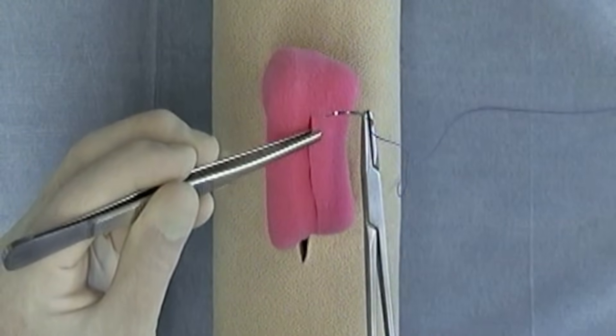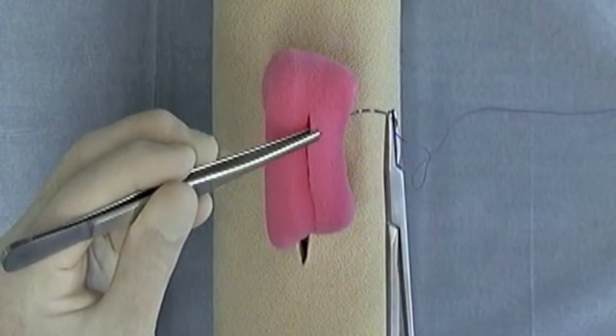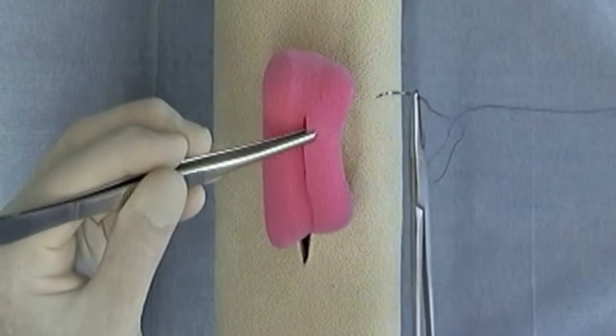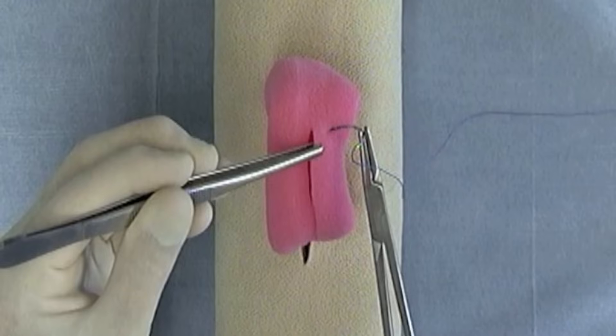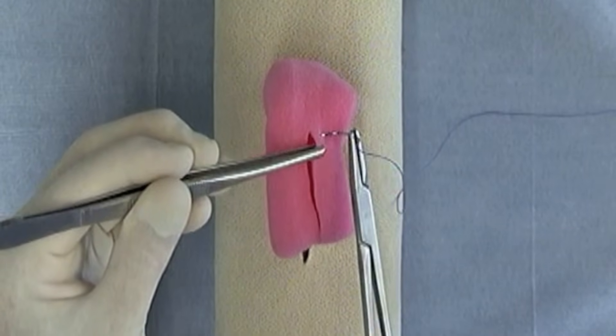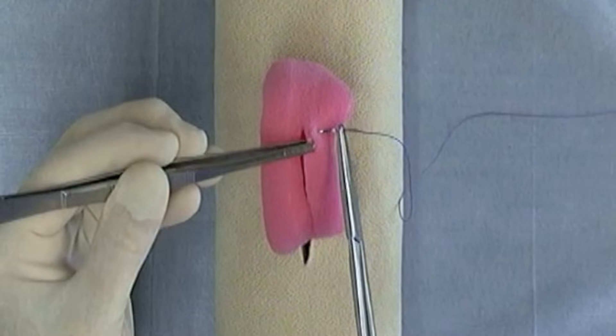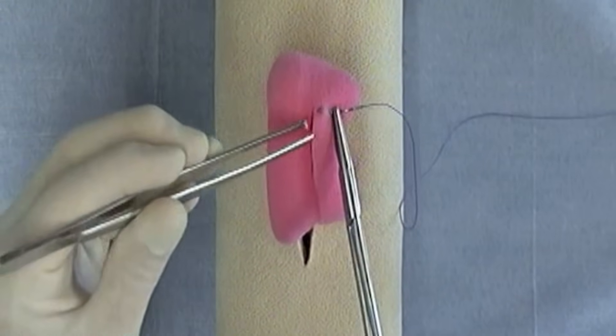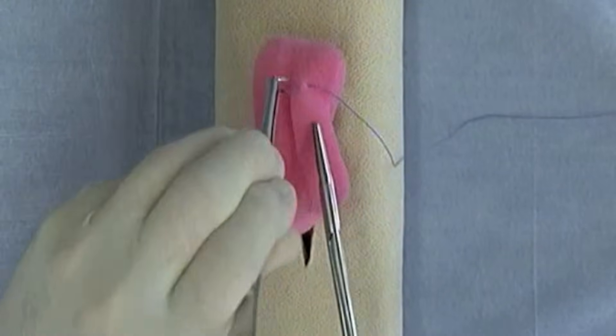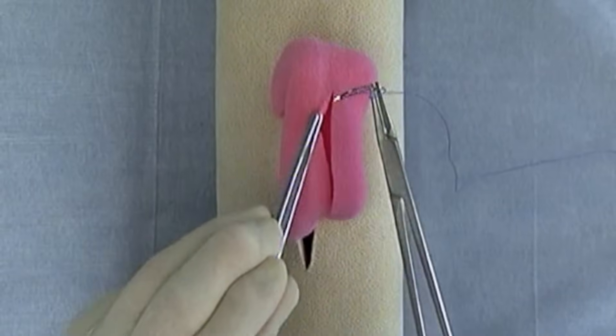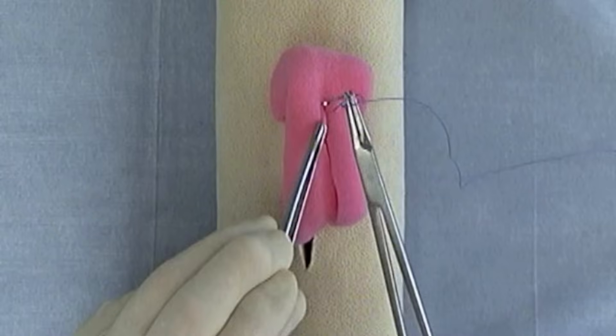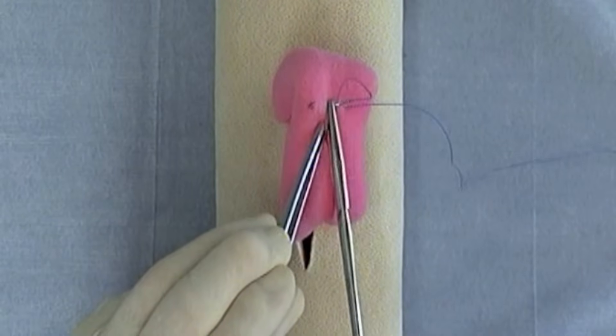A Lembert is a vertically oriented suture pattern, very similar to the vertical orientation, for instance, with the vertical mattress. You're going to go into the intestinal wall and out of the intestinal wall on the same side of the incision. Reset your needle, and then on the other side, the far side, you're going to go into the intestinal wall and out of the intestinal wall.